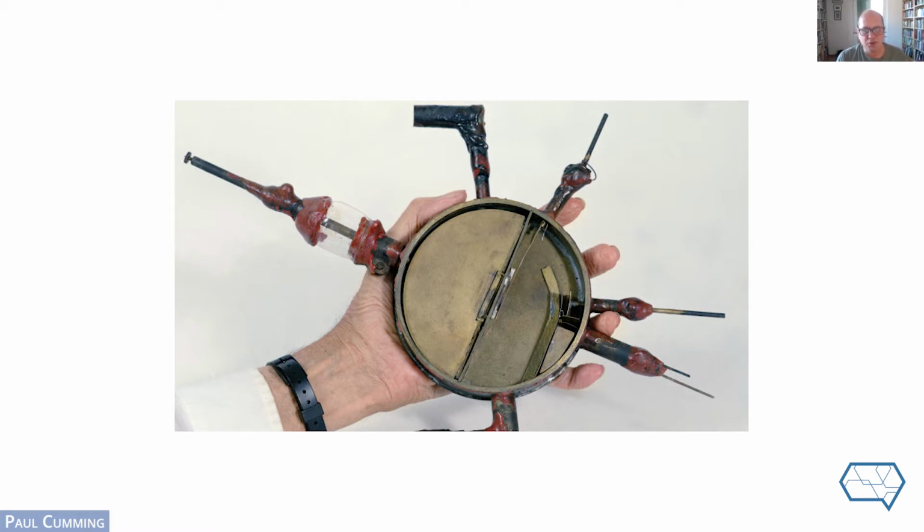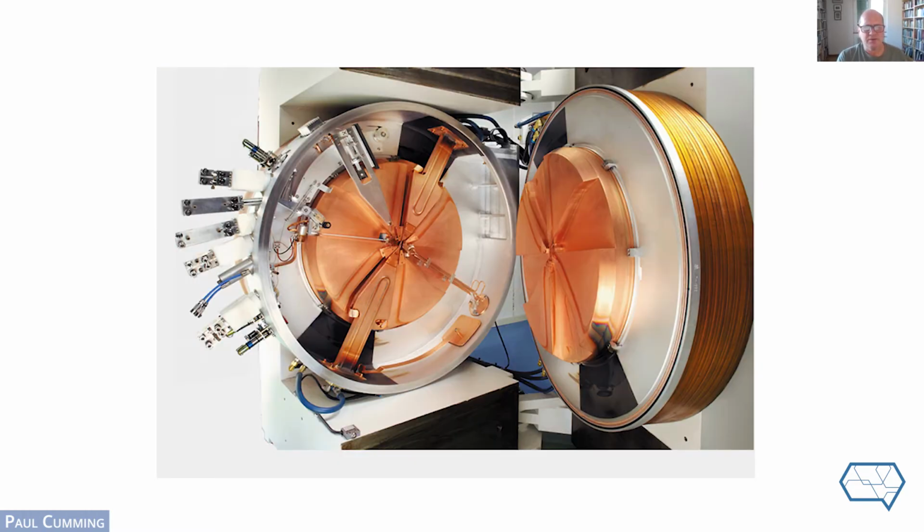You can see the two so-called Ds. It consists of segments in which there's an oscillating electric potential applied. And inside there would be, in its normal operation, a vacuum. And placed between a fixed magnet, this causes particles in the cyclotron to accelerate as they spiral outwards. And in the next slide, yeah, that's what I meant to show in this order.